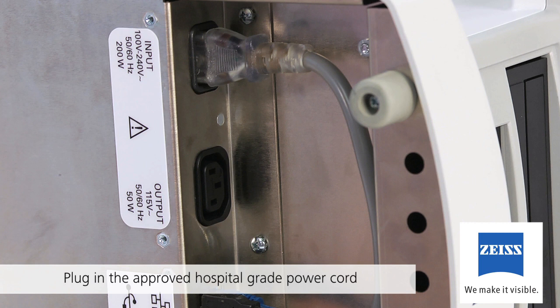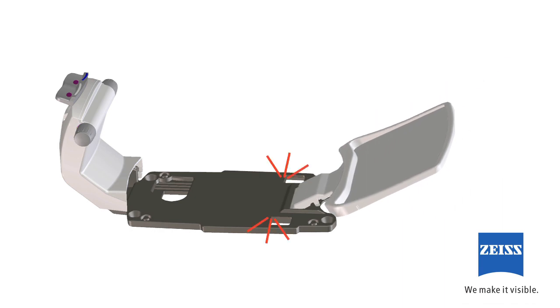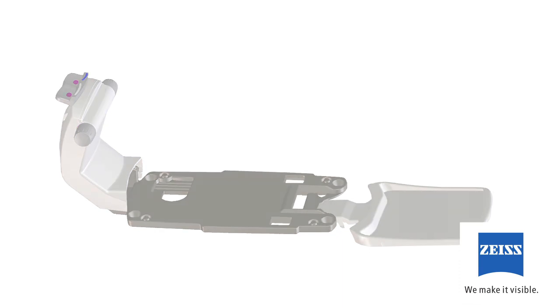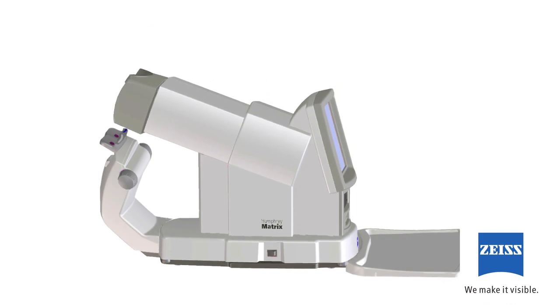Once everything is connected properly, turn the instrument upright. Now it is time to assemble the chin rest with the keyboard tray, which will serve as the base of the instrument. Simply unpack the chin rest and follow these instructions. Snap the keyboard tray gently into the dark gray base. Lay the keyboard tray flat. Sweep the attached cords to the right side of the instrument, which is the side with the on-off switch. Then gently lift the instrument off its side and place it carefully into the base.